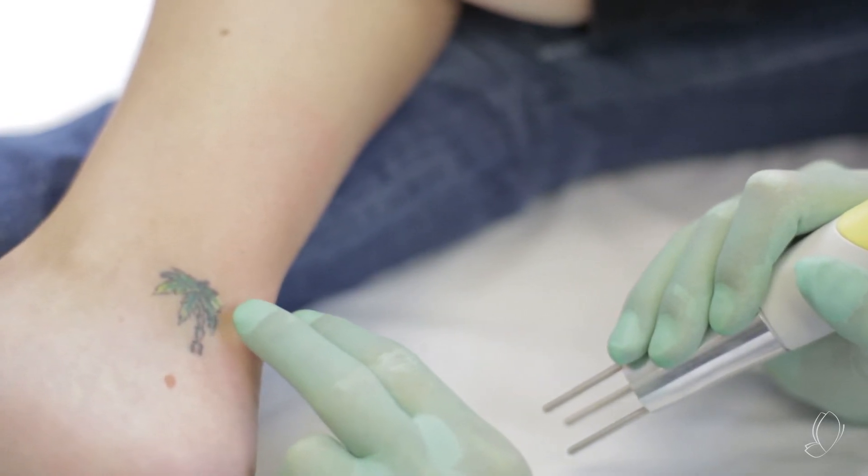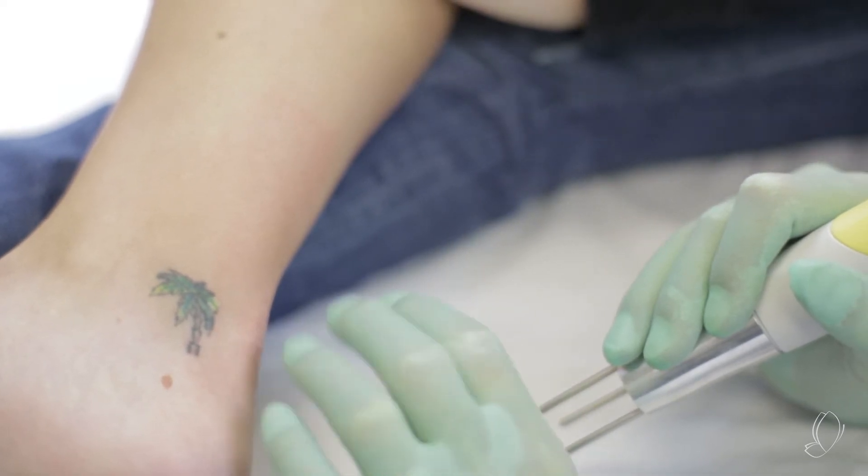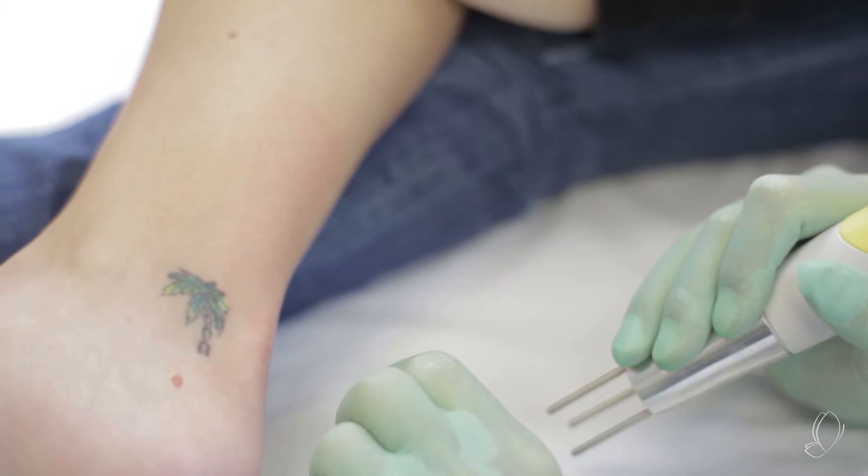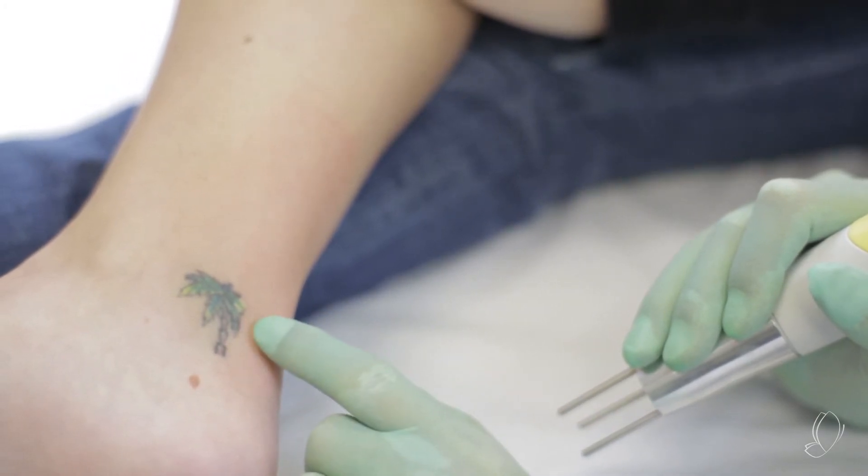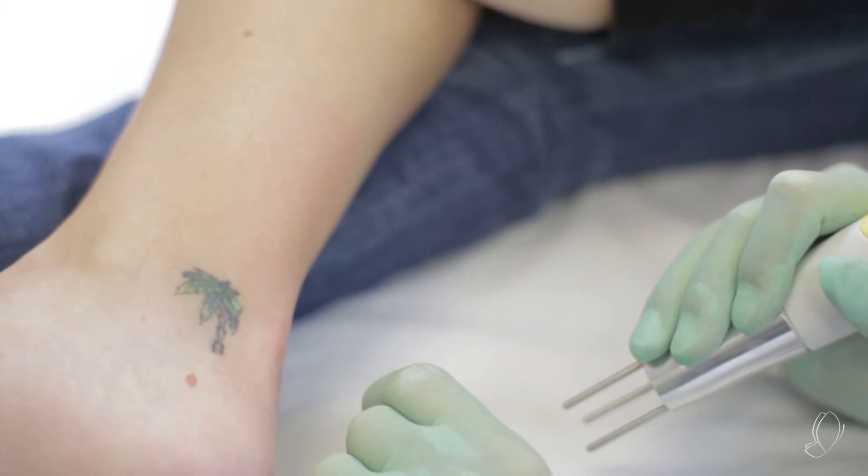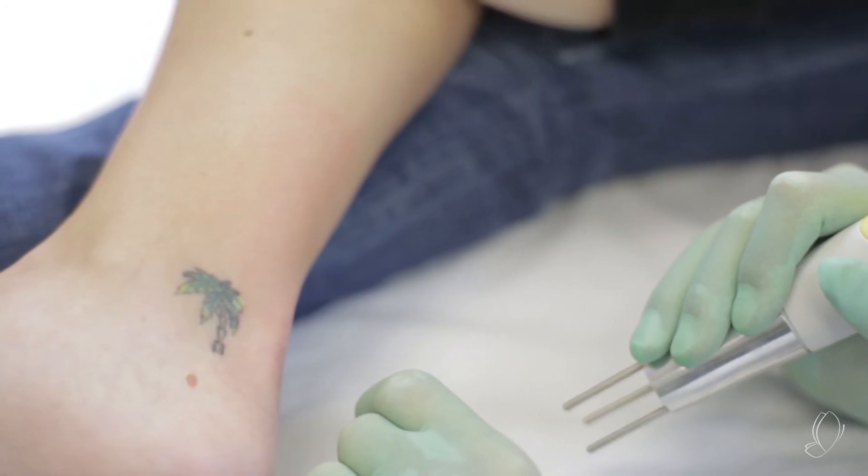So what we're going to do now is, now that we've done one test spot, the patient survived, we got the treatment result we're looking for. I'm going to go back to 10 hertz or 10 pulses per second and we're going to try to go through this entire tattoo probably in less than a minute.